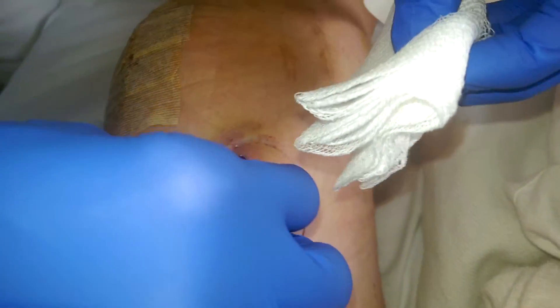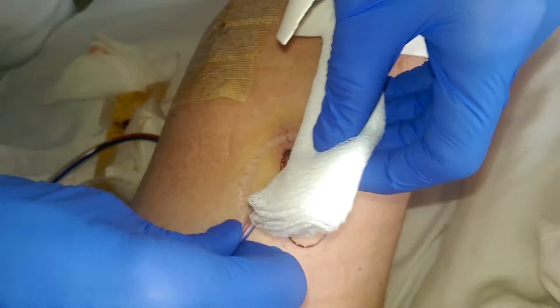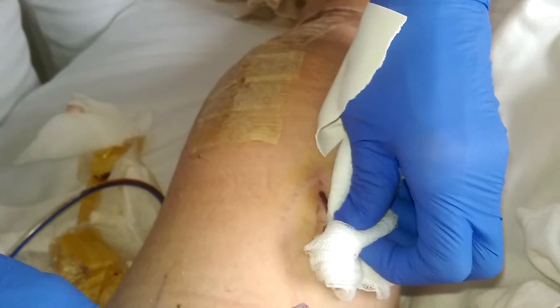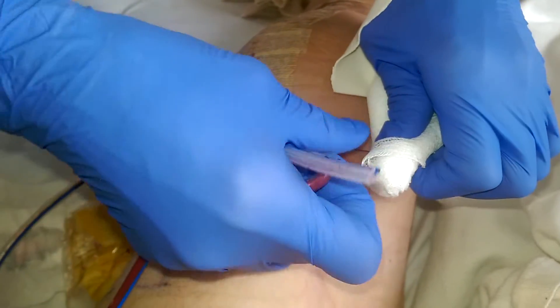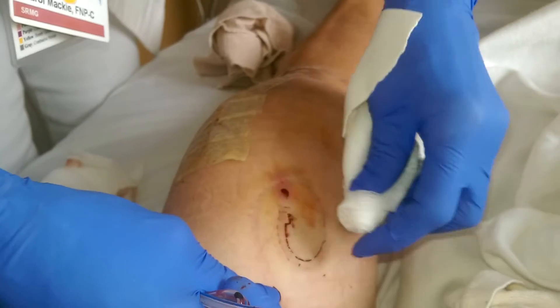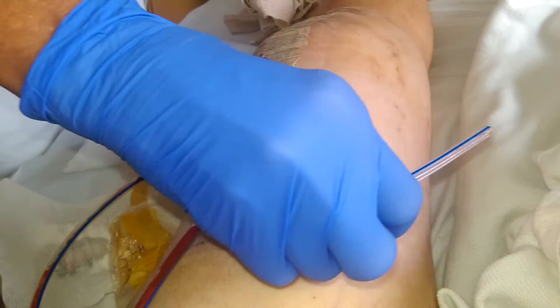We're going here. I don't want you to hold your breath. One, two, three. One, two, three. It's okay — I don't want that little clot to come out. Dang it. It wicks in there if you don't pull it out. All right. One down.